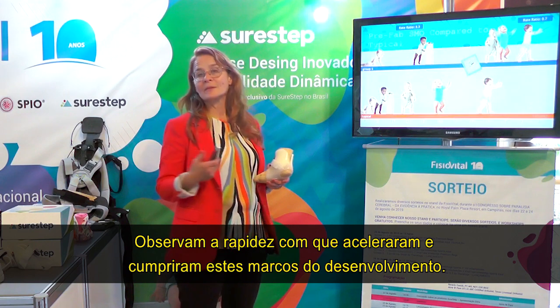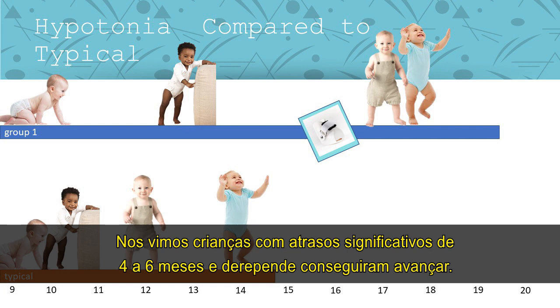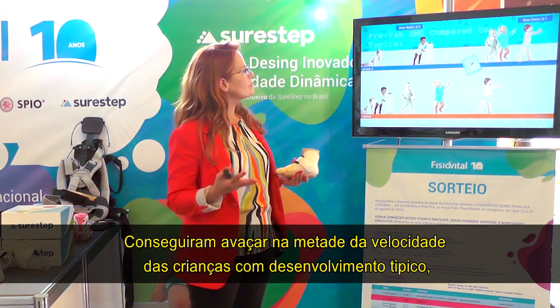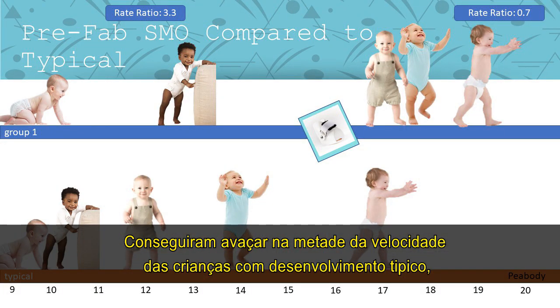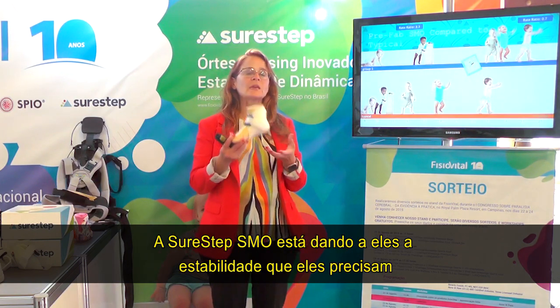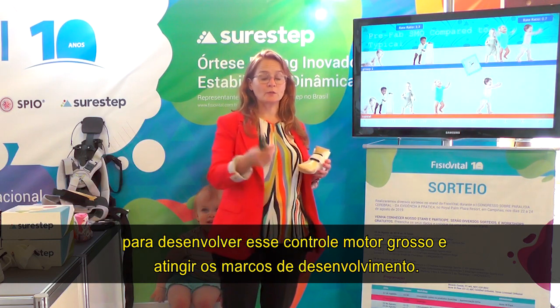We saw children with significant delays of four to six months all of a sudden move forward. In fact, they moved more than half as fast as their typically developing peers in gaining these skills once we intervened with our SureStep SMO. The SureStep SMO is giving them the stability they need to develop those gross motor milestones.